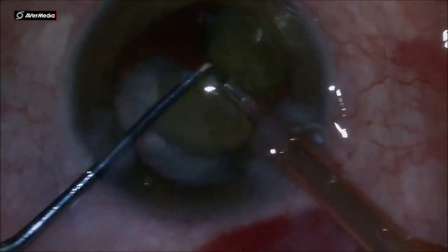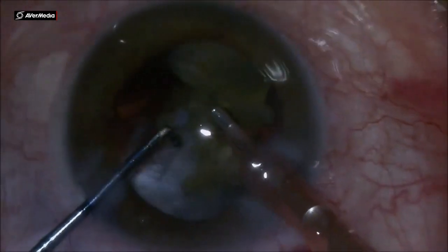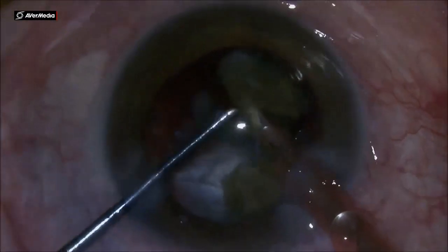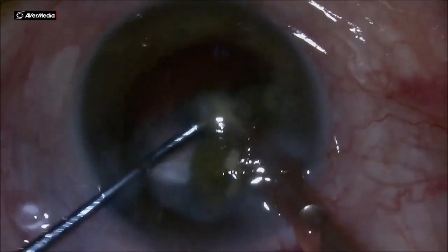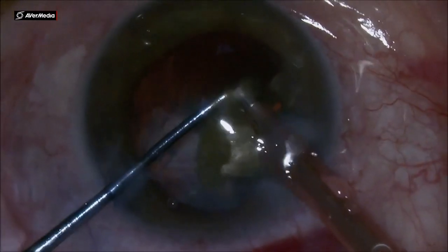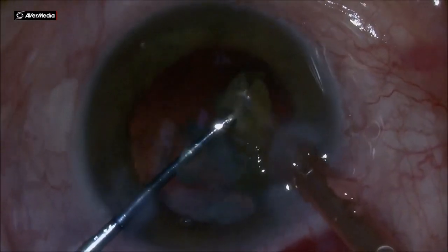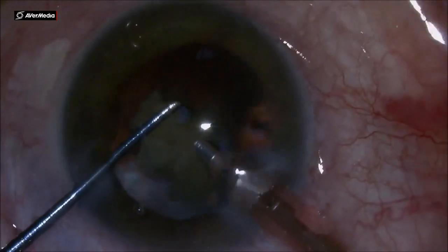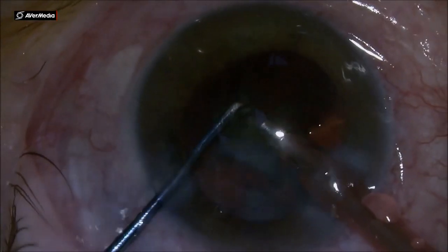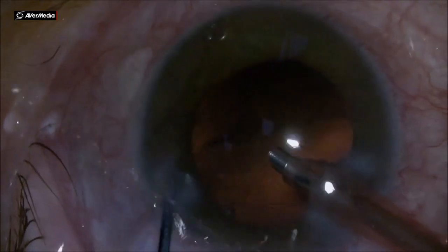Have the chopper at a lower level to protect the posterior plate. It's a very good idea to keep it in front and lower than the phaco needle. I use the bevel down to have a better grip on the pieces, but not pressing down the foot switch too hard. If you notice, I'm just taking smaller and smaller bites on all this leathery cataract, especially at the last fragment. And the phacoemulsification is finished with no complication.